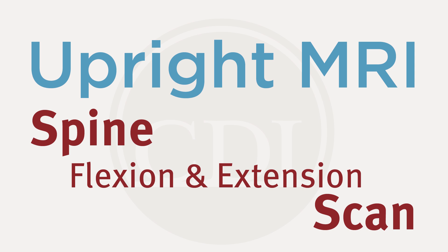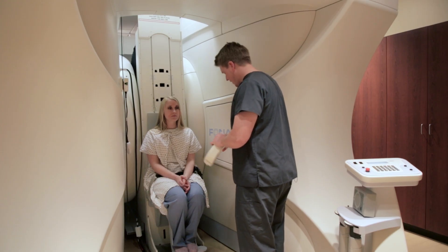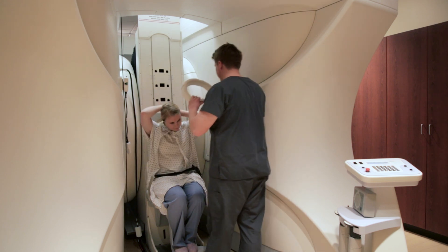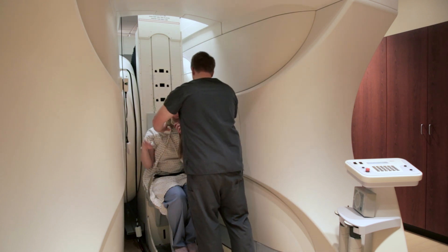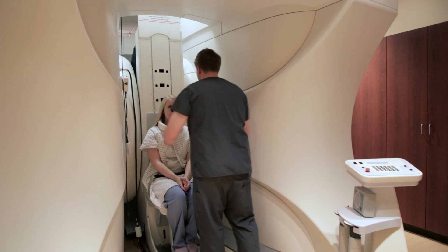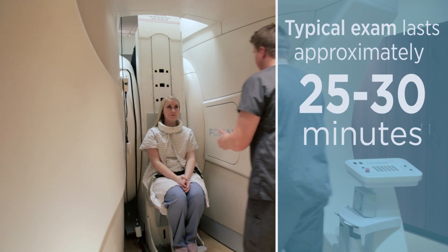You need to put this piece around your neck, so I'll ask that you try and keep your hair out if you can. The majority of the exam is going to be done with the patient in a neutral position — that's with them comfortable — and that takes about 25 to 30 minutes.